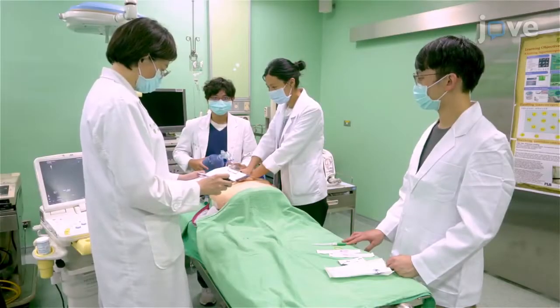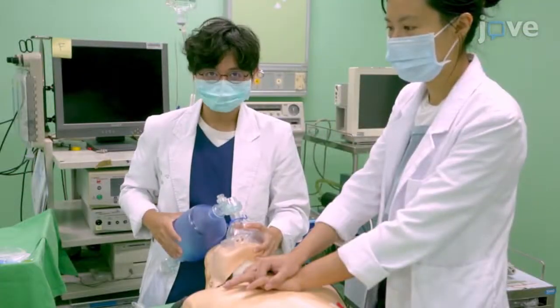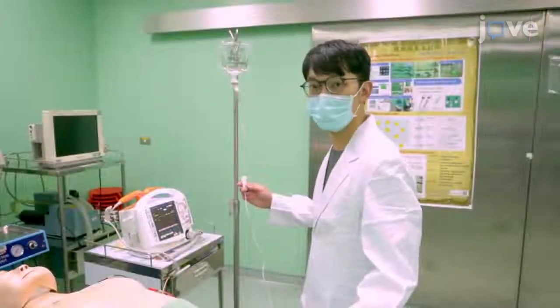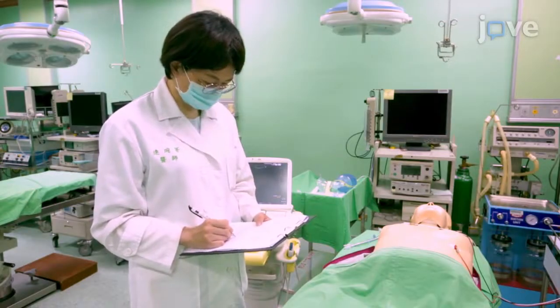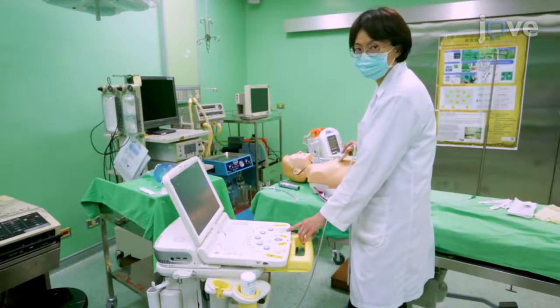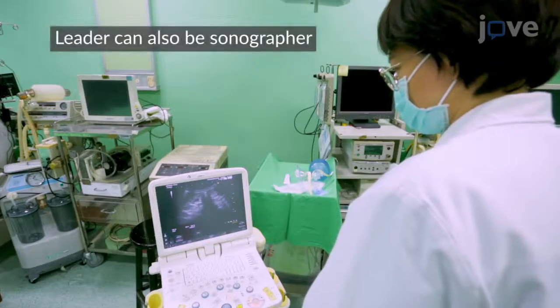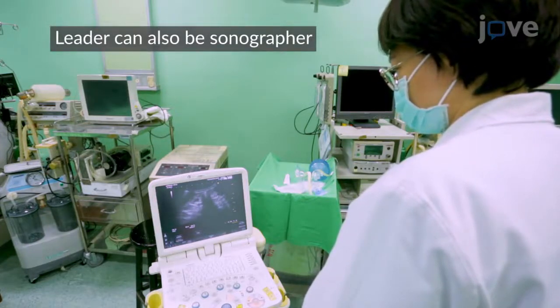Ideally, a resuscitation team should be comprised of a leader, a member for airway management and ventilation, a member for chest compressions, a member for defibrillation, a member for intravenous catheterization and medication, and a recorder. A sonographer should also be present as an independent member of the team, who is well trained and experienced in resuscitation ultrasound, and who can intervene and interpret the ultrasound images in a timely manner without interrupting or delaying the resuscitation efforts.